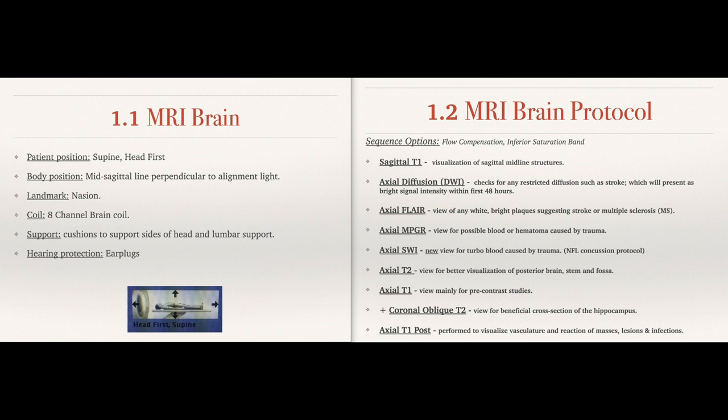Body position is going to be mid-sagittal line perpendicular to the alignment light. The landmark is the nasion. On the coil there are some markers, so at the end of the day you're going to get that head inside the coil comfortably. Make sure the nose is straight — you don't want it tilted left or right because then you've got to angle your slices inside the scanner. Try to get it as centered as possible. For support, put something right under the legs — that tends to be a nice comfort on the back.